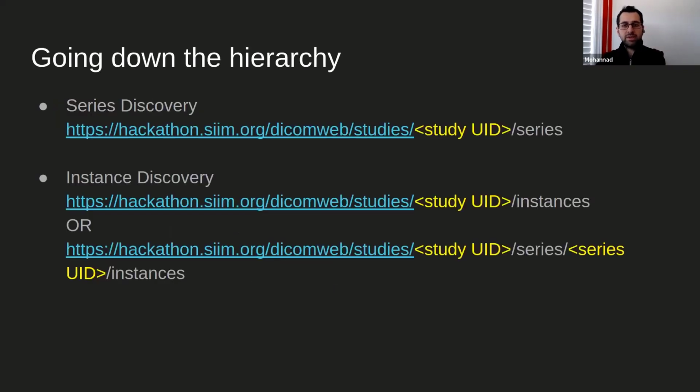Now, the reason why this is called the REST API is because of what you see on my slide here. The way you go down the hierarchy is very logical. It's almost like a folder structure. Imagine if you manually had to store your DICOM files: you create a folder for the study, then a folder for the series, and then folders for the instances. This is kind of how it works. There's a path.